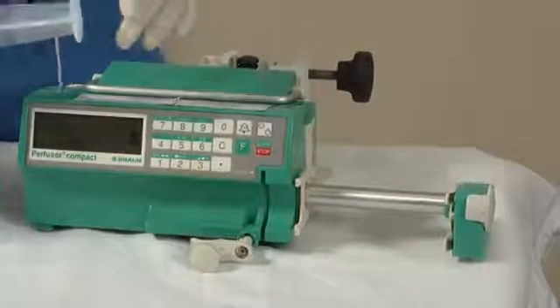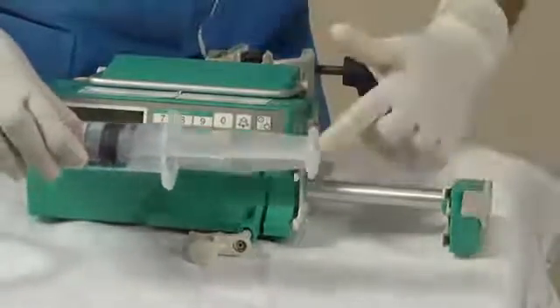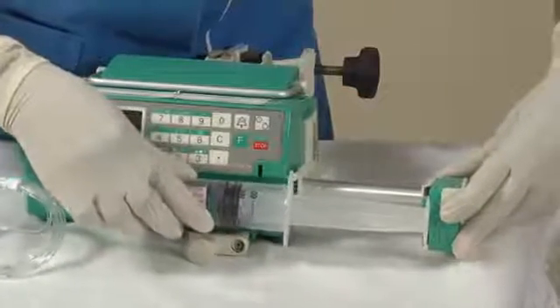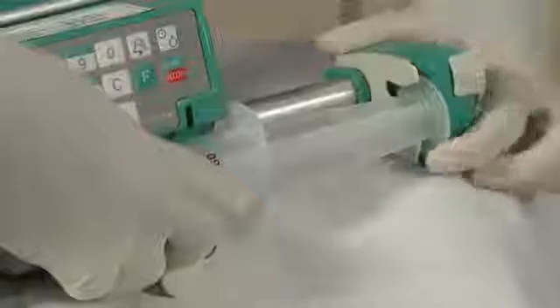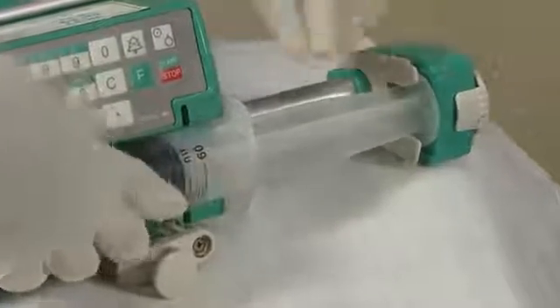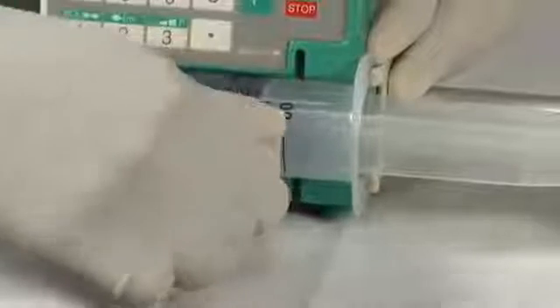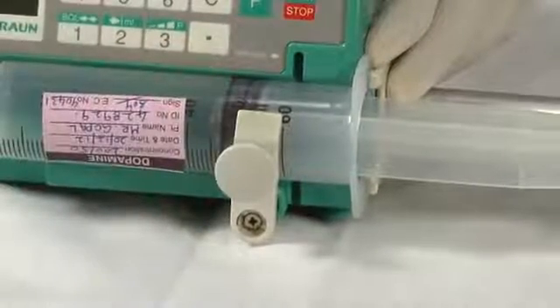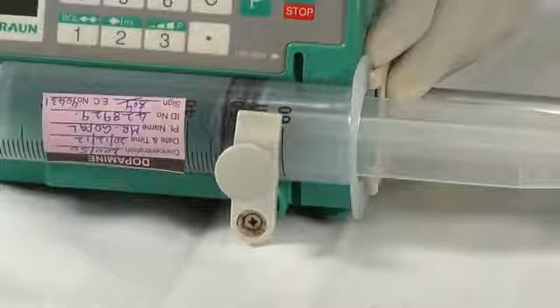Now keep the piston of the syringe over the side lock and then slowly bring the end to this slot and gently push the syringe inside so that it is perfectly placed and the lock snaps to secure it. If the click isn't heard, the lock hasn't closed fully. After that, lock the syringe into place using the front lock by turning it up. Now the syringe is perfectly placed in the pump.